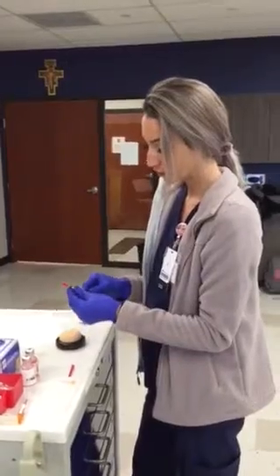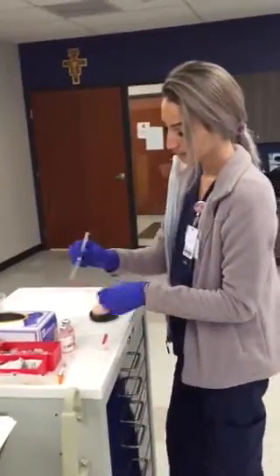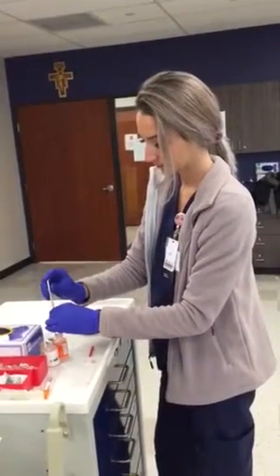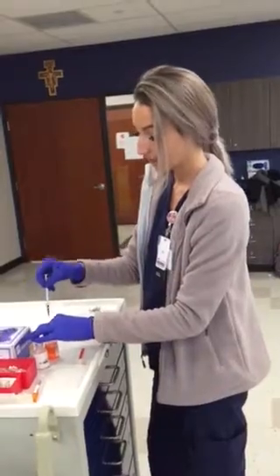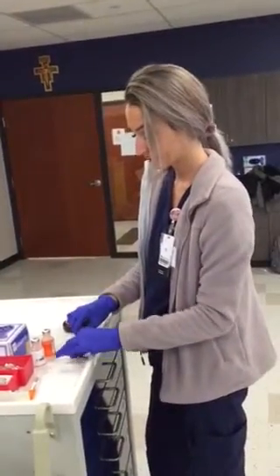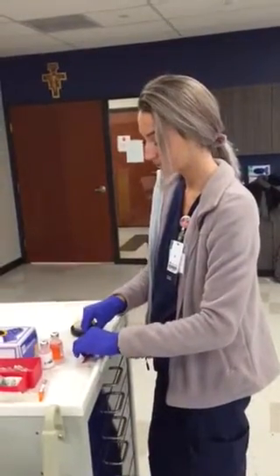So I'm gonna go to what she needs. 1, inject and clear. Okay, and then when I take this needle out, I'm gonna swoop it in here and then release it. Nothing ever hits the floor, I'm not touching the needle.